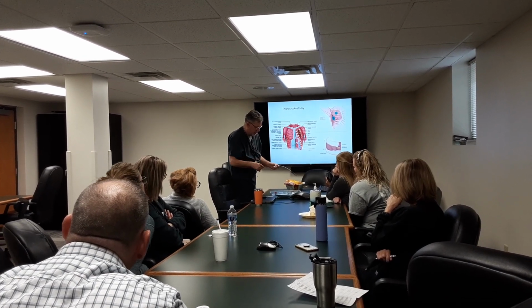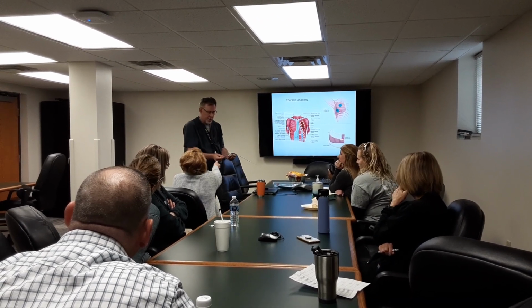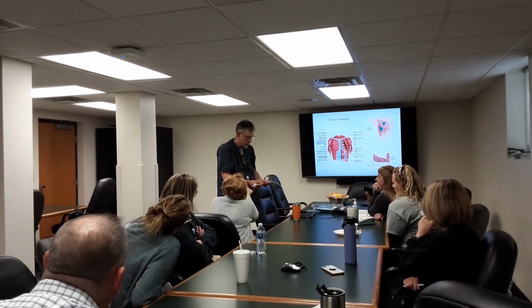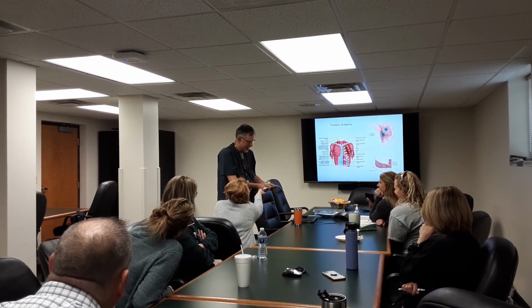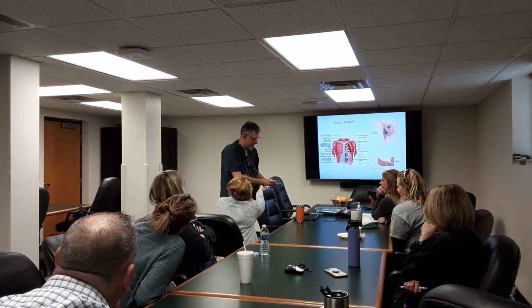And so somebody else will be controlling the wire. I'll be you. So, and then we'll pull this out. Am I supposed to? No, you don't want to pull back, right? You want to hold right here at the tip. Okay, I got it. And I'm gonna pull this back, and so it's coming back, and then it pulls out too.